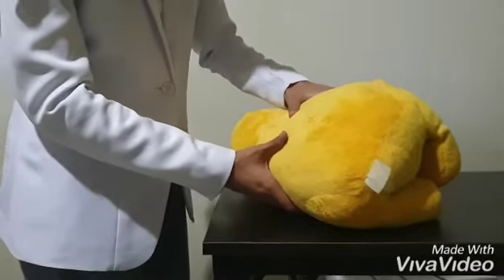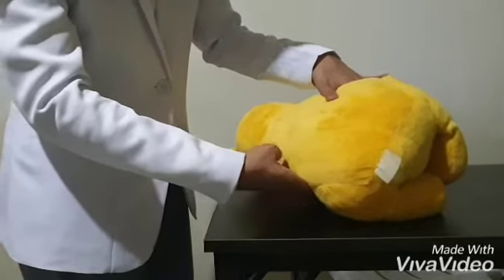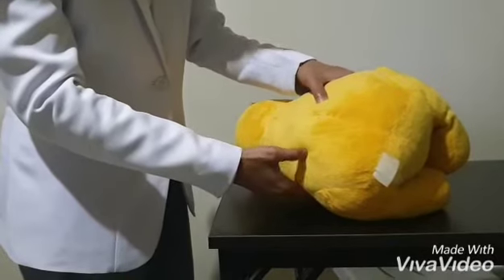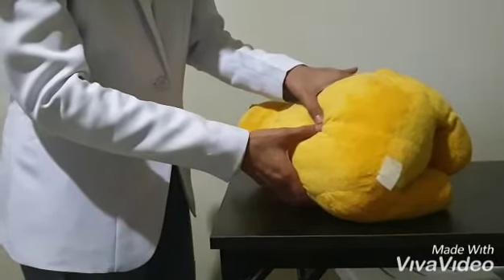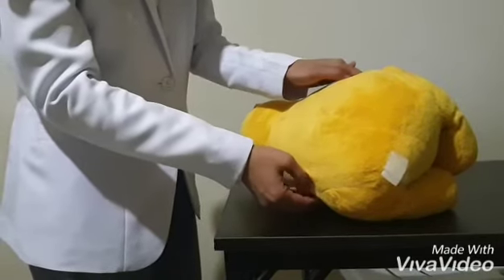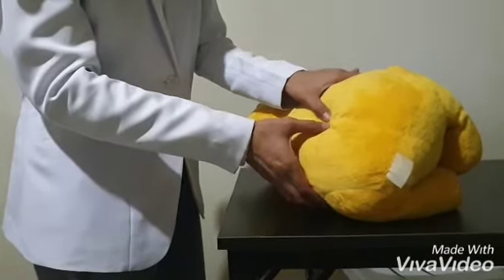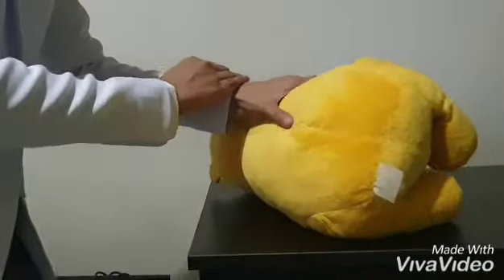Landmark is important both for the application of anesthetic and performing lumbar puncture. Identify the iliac crest on each side of the infant. Place one finger on each crest and trace your fingers together across an imaginary line. This will lead you to the site of puncture in the midline at about the level of L3 or L4, below the end of the spinal cord.